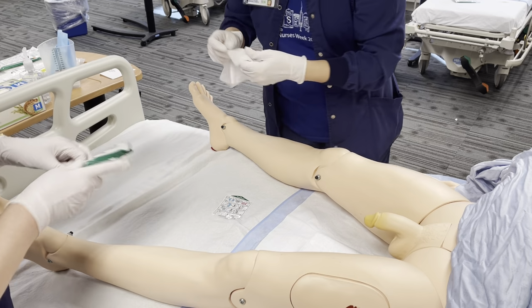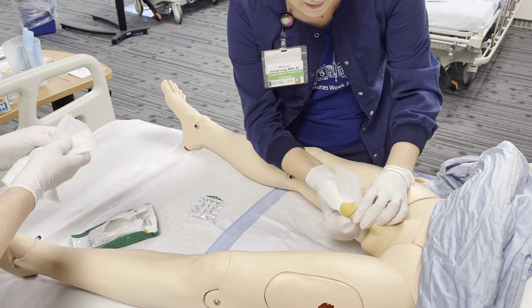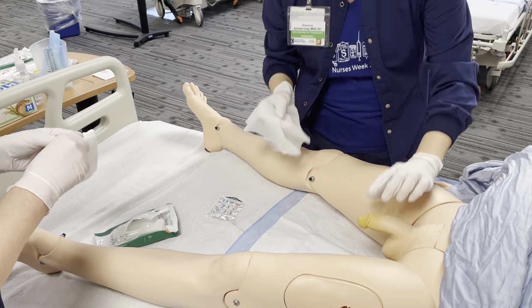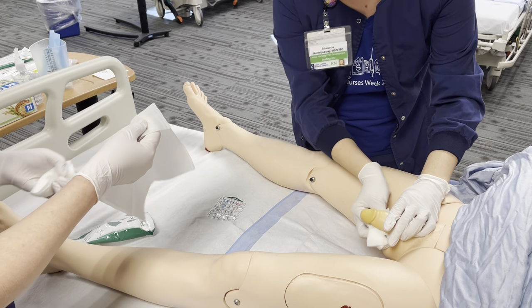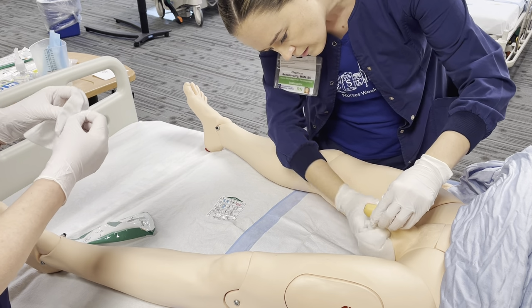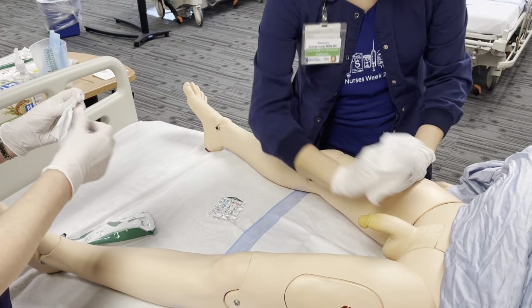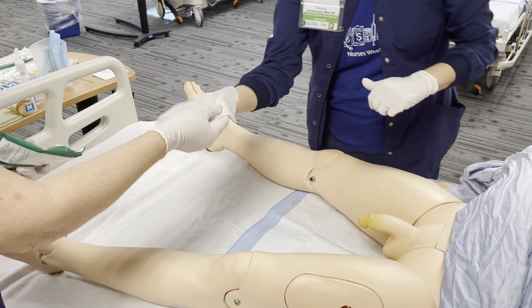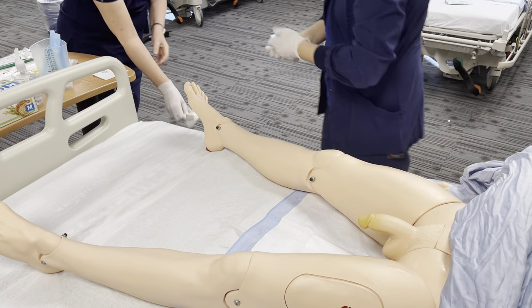You want to hand me the subsequent ones? So the first wipe is just going to be right here on the tip of the penis, moving outward. The second wipe is going to be the same. Thank you. The third wipe is going to go underneath and the scrotum down. And then the fourth wipe is going to be in your groin. The fifth wipe will be on the other side. All right. Doing okay, Mr. Gray? Doing fine, thanks.